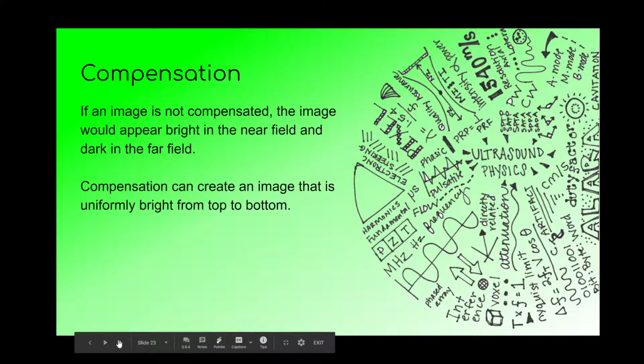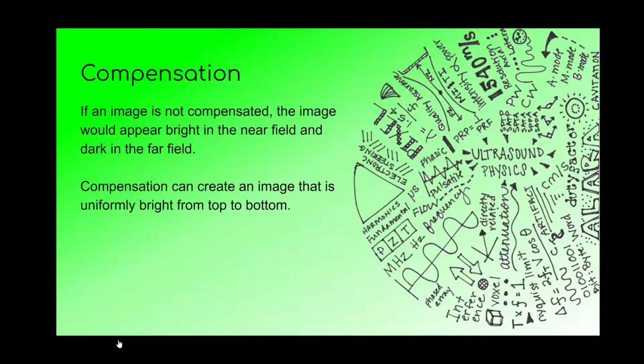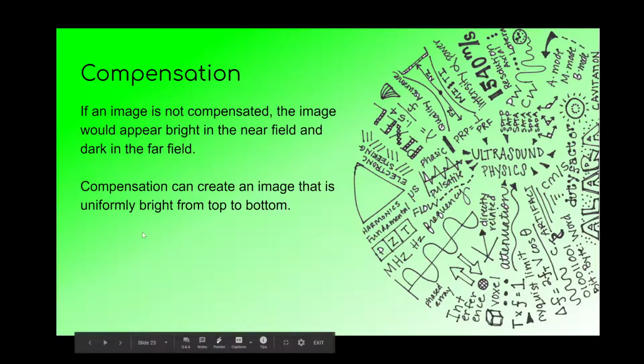So if we didn't have compensation, our pictures would look very dark in the far field and very bright in the near field where the signal is strongest. With compensation, we can create pictures that are uniformly bright from top to bottom.